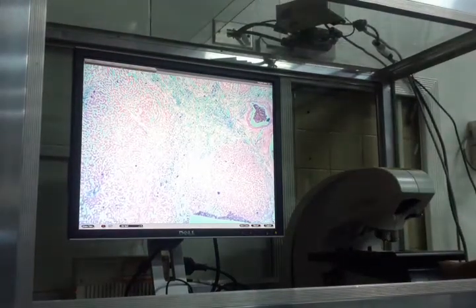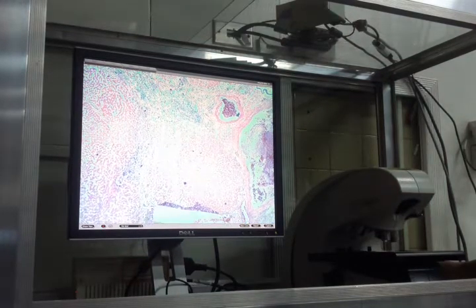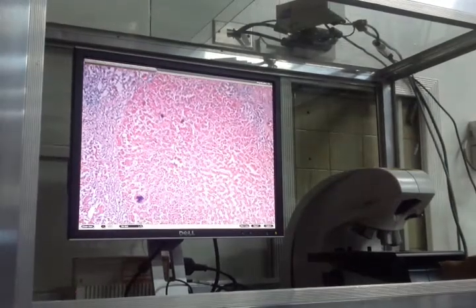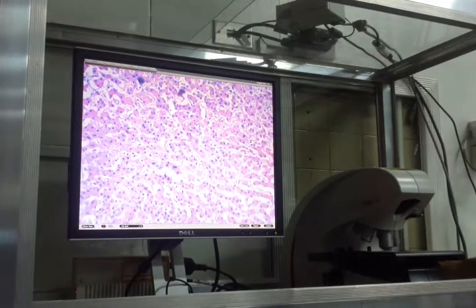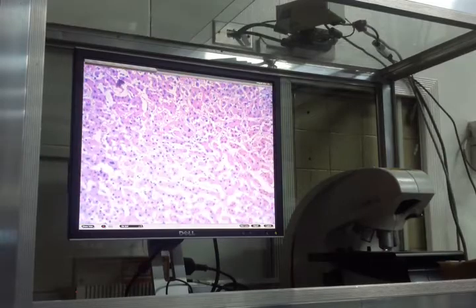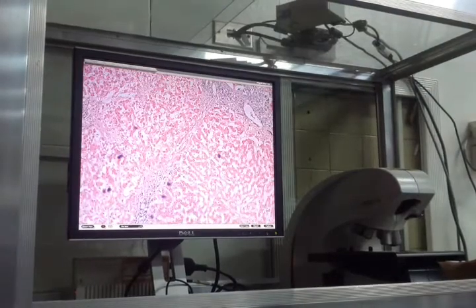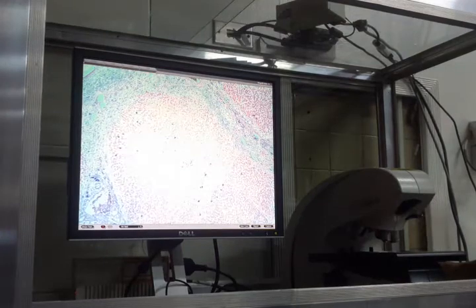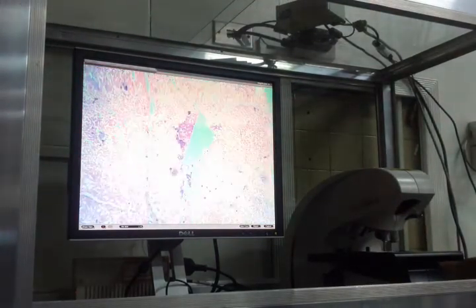Napakita ko na yung slide na sa inyo kanina, no? Pag pinopos nila yung mga hepatocytes na may focus, hepatocytes. Ayun. Steatosis. Ayun. Marami-rami.